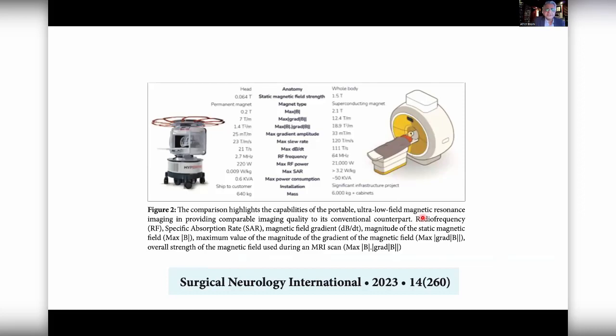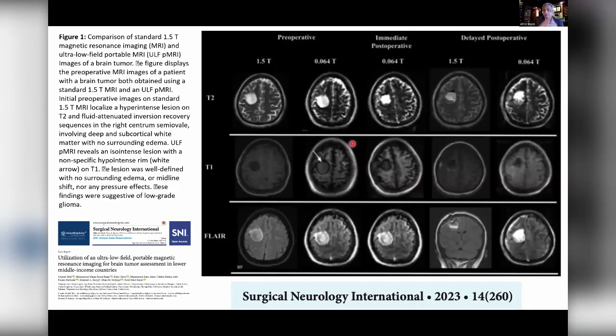The benefit of this, obviously, is I'm not going to go into details because this talk is not about comparing the ULF MRI with the regular MRI. It's more about the global neuro-oncology aspect. But still, the power of this thing is obviously it's ultra low field, but it takes so little energy, 0.6 kVA. And the weight of this thing is 640 kilograms, and you can roll it. So there are a lot of things that are world apart. But if you look at the MRI, they actually do not look that different.